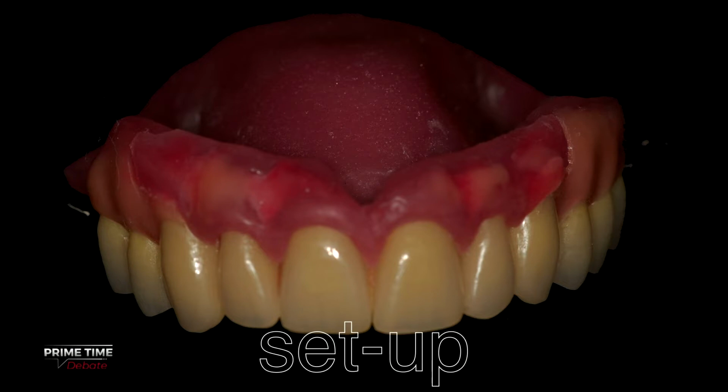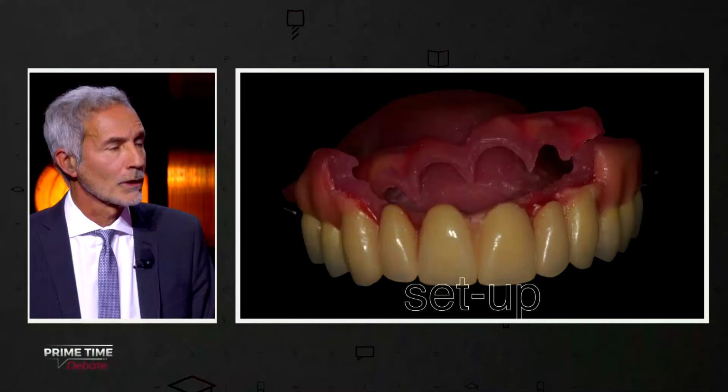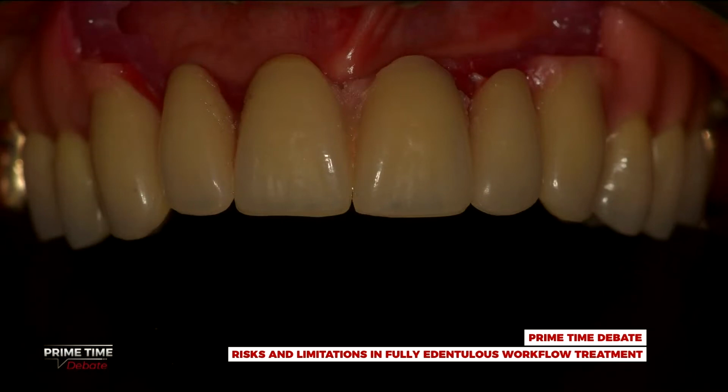If you put in the flange, you can check a removable solution. This is the picture without the flange, the fixed solution, and with the flange, the removable one. It means that if you check it in the patient's mouth, then you move to the face in order to understand if this type of rehabilitation can be the best solution for that specific patient.